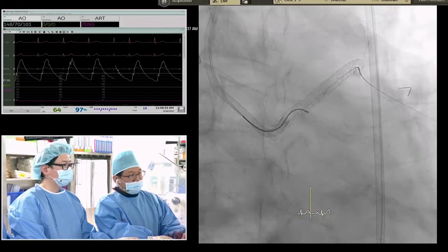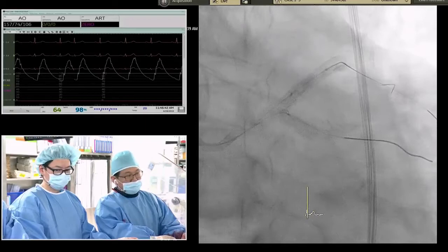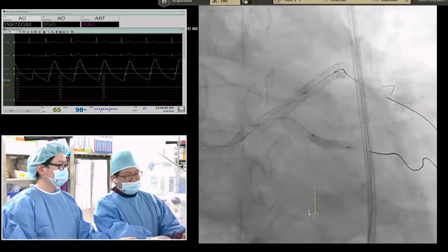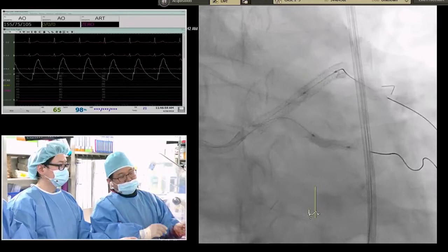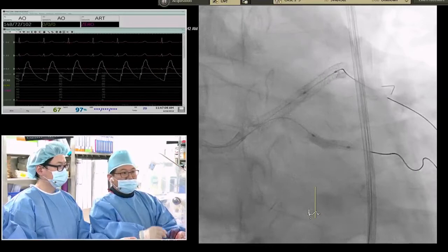Fortunately, the wiring was successful. Using the anchor, this is a 1.5 circumflex balloon. This is 2.75, for the full high pressure balloon. Yes, the vessel size is 3.0. But to avoid complications, because it is a very calcified lesion, inflating to the full vessel size can sometimes damage the vessel. So I like to use a smaller size with very high pressure. This is my preferred way: 2.75, high pressure up to 28.